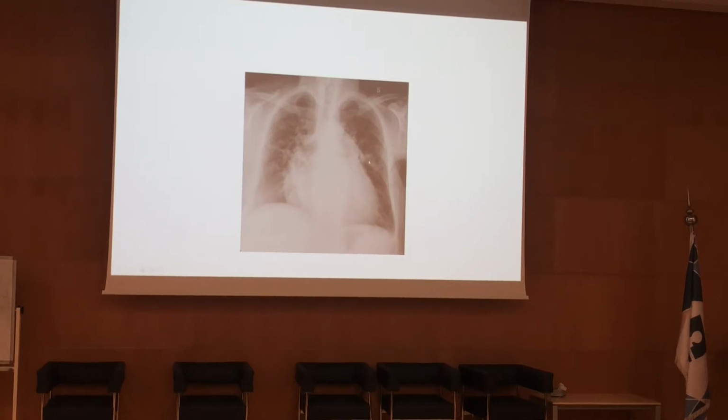About this one. So what do you think about the heart here? Cardiomegaly, excellent. And what do you think about the lung tissue here?